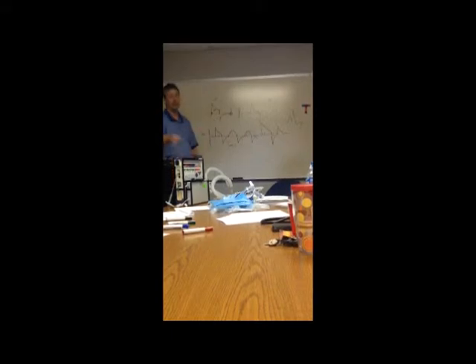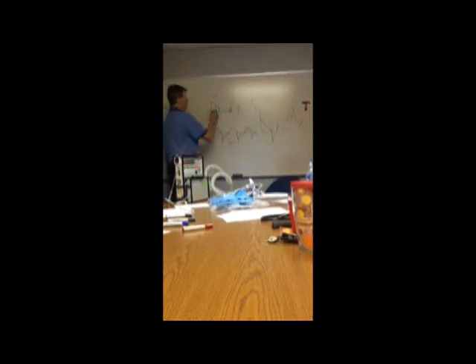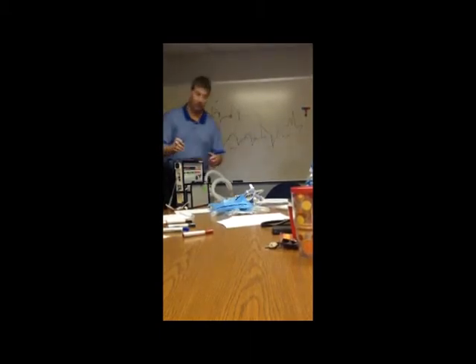That's pretty much it. In volume ventilation, if you want 500, it's going to give them 500. There are some things that change based on their lung stiffness. If their lungs are really stiff, you'll get your 500, and this is why people like this mode. If, say, I'm on the vent for 2 hours, and I'm in CHF, and I'm not real stiff to begin with, and I'm on this mode up here, it's going to give me 500.